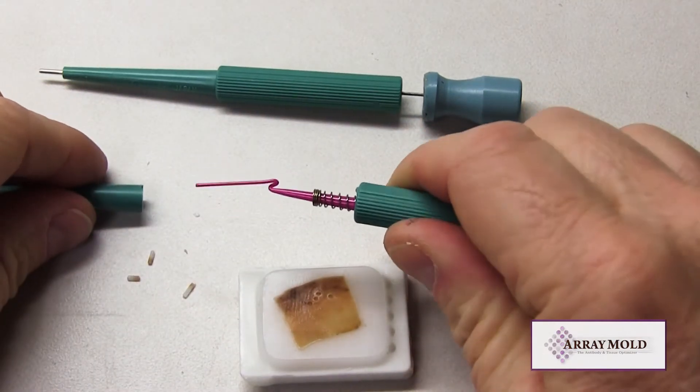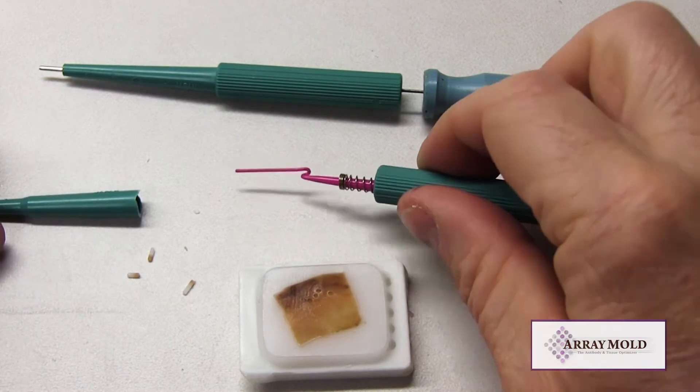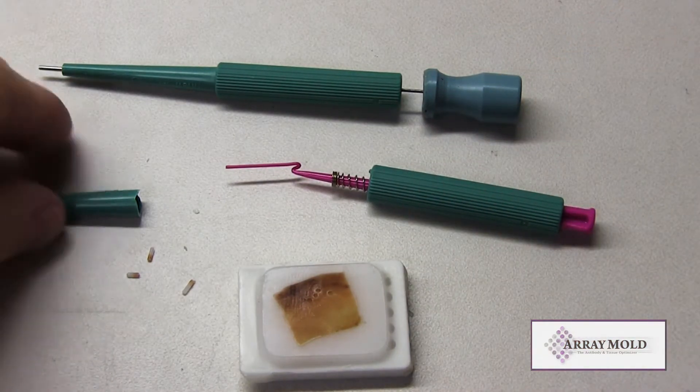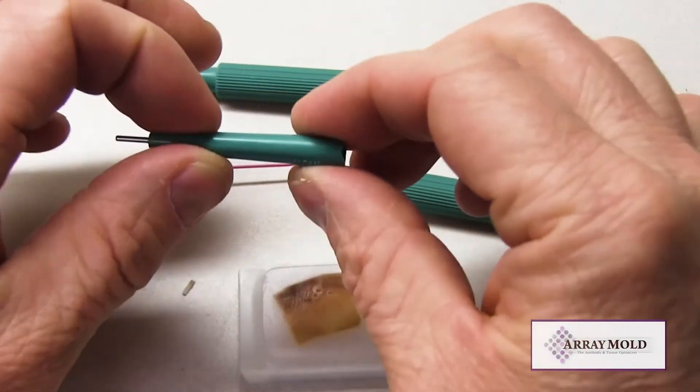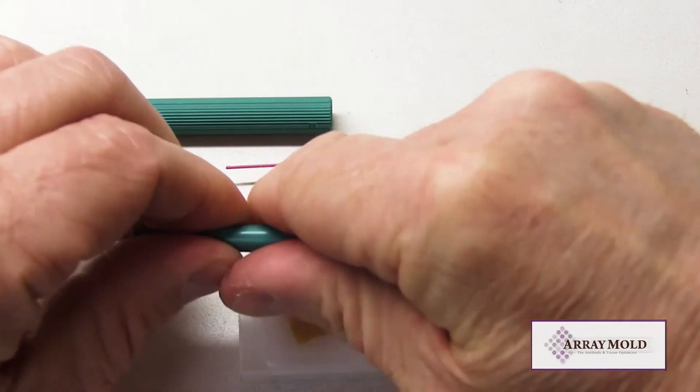The Array Mold has been around for 10 years and is the first and original silicone mold TMA instrument. We tested the plunger needle early and found that it was inadequate for TMA construction, and that is why we went with the needle and stylet design instead of the plunger needle.